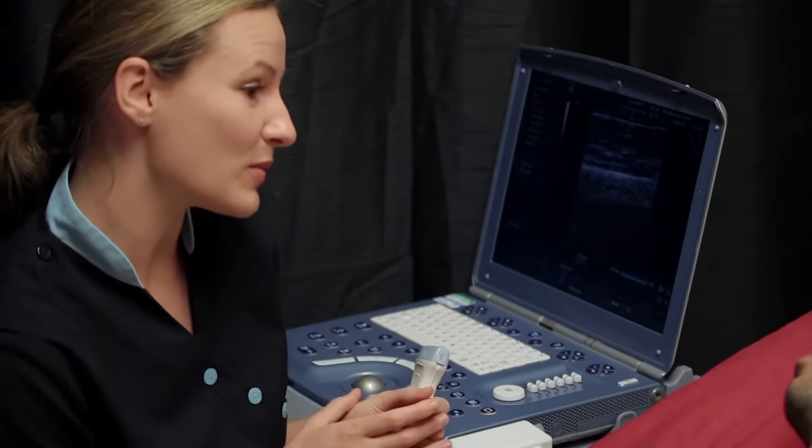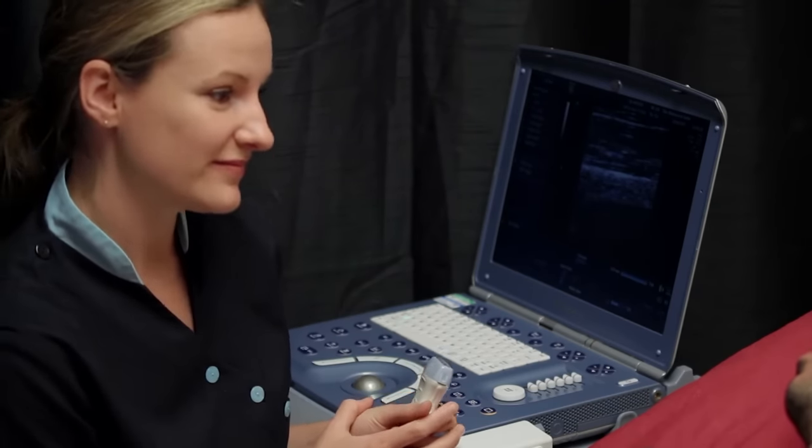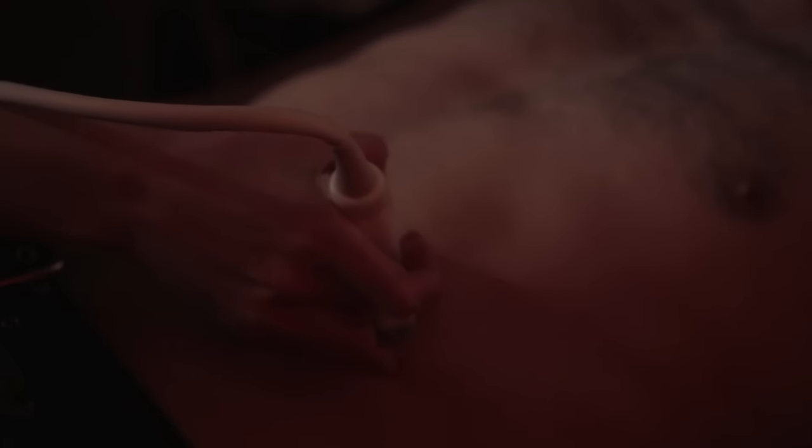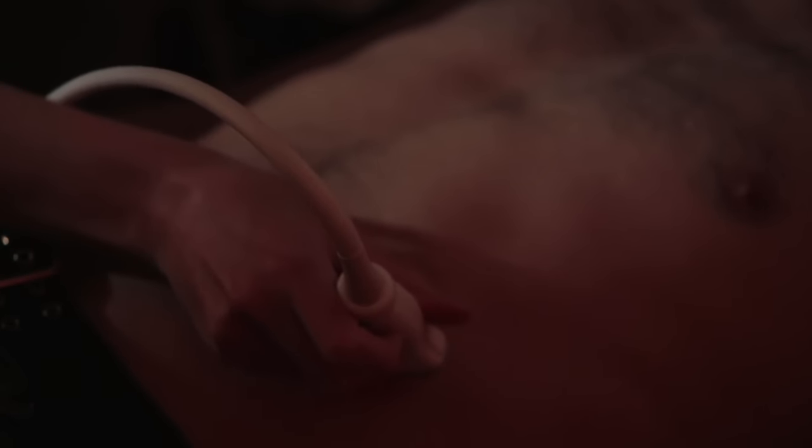The kidneys are also scanned at the end of the examination, as sometimes testicular pathology can be linked to the kidneys. The scan is carried out by an expert sonographer.